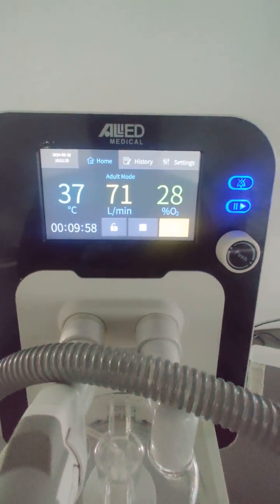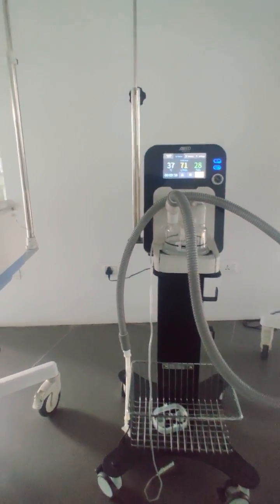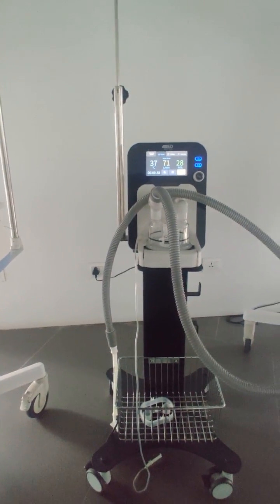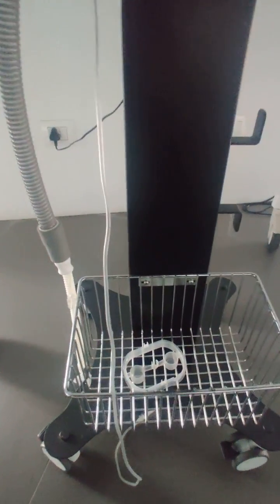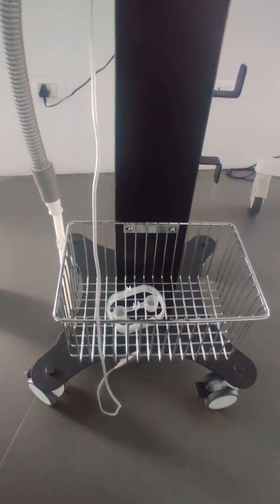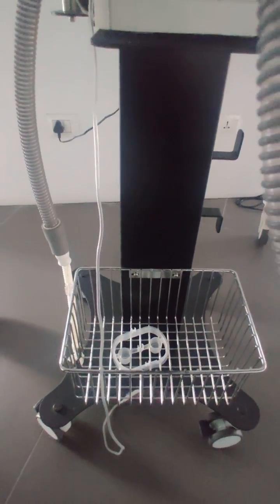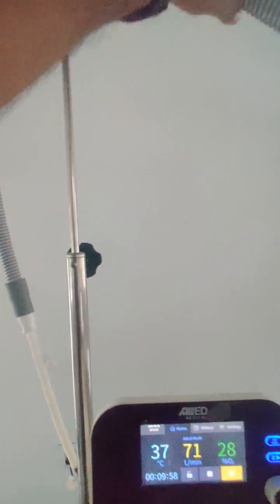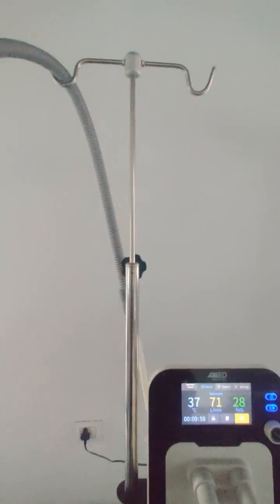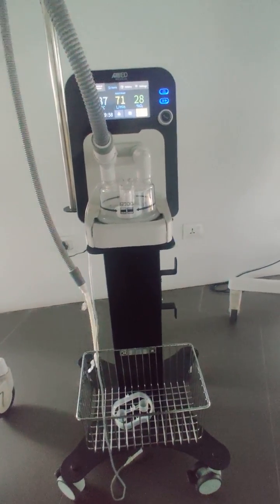The HFT device is supplied with a trolley as a standard accessory. The trolley has four wheels, with brakes on the two front wheels. It includes a basket for storing accessories related to the HFT device, and a circuit arm for mounting the breathing circuit. This trolley is supplied as standard with the HFT machine.